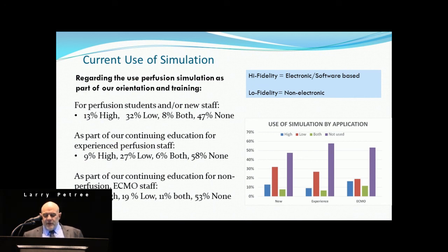As a part of continuing education for non-perfusion ECMO staff, which is interesting because the Eigenflow system is designed simply for ECMO training, 17% high, 19% low, but 53% none. So how are non-perfusion ECMO staff being trained to help maintain those circuits if they're not using simulation? That must mean they're doing it all OJT with live cases. And that may not be the best scenario. So there may be an opportunity for simulation here.